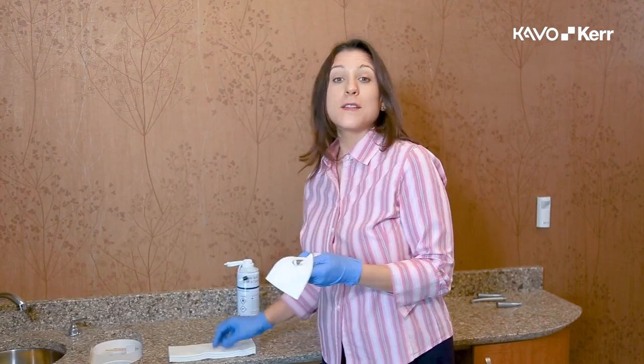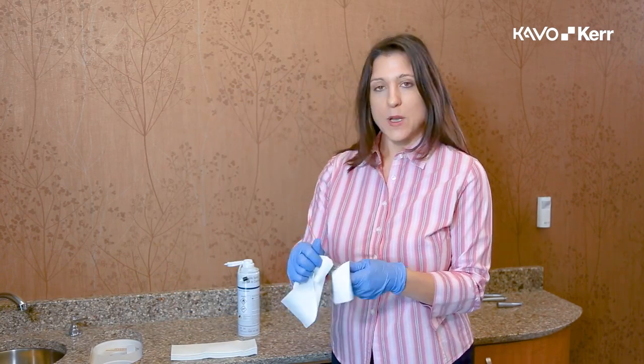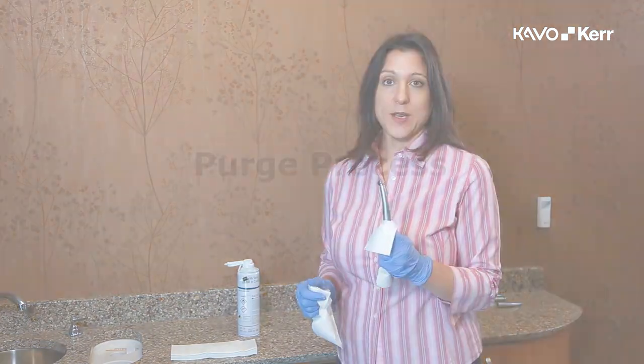Wipe down the exterior of the handpiece with a dry towel to remove any expelled fluid or debris. The handpiece should be completely dry at this point.